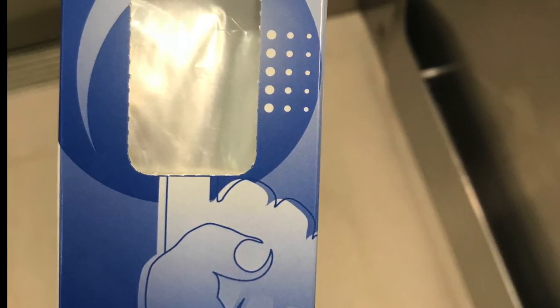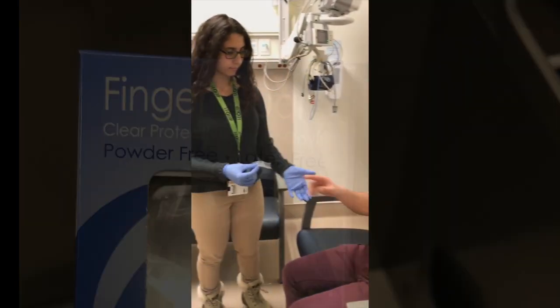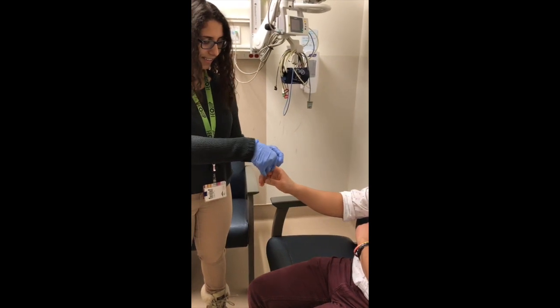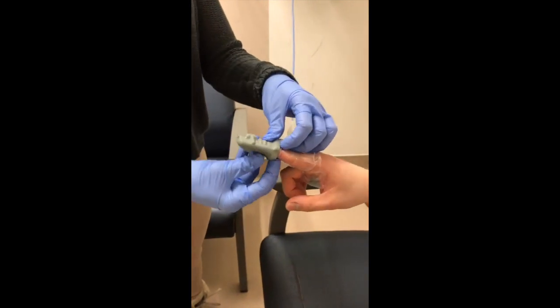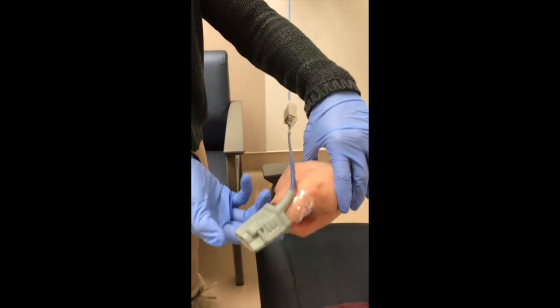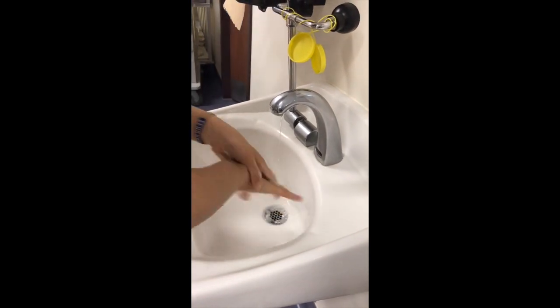When using pulse oximeter finger covers, as seen in this video, be sure that the patient performs hand hygiene. Then, taking a finger cover, place it on the patient's finger. Next, insert the pulse oximeter onto the patient's finger. Please note to wear gloves during this step if you are going to be in contact with blood or bodily fluids. After cleaning each piece of patient care equipment, be sure to remove gloves and perform proper hand hygiene.